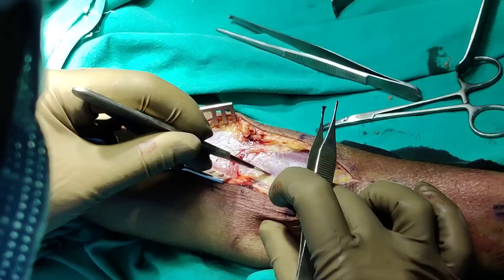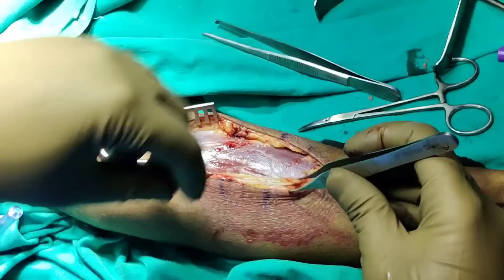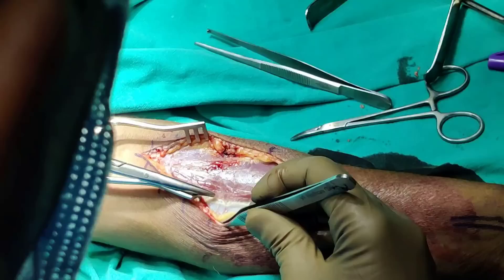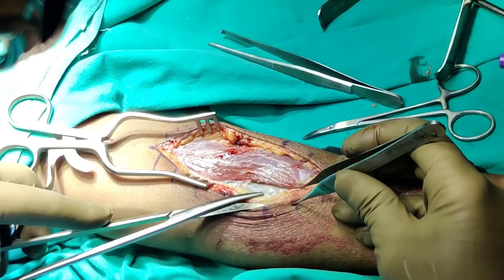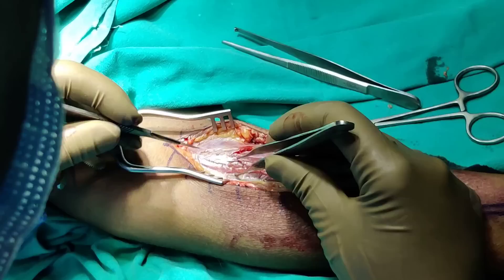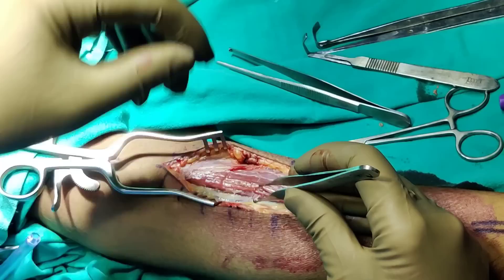The next step is to divide the fascia. You can see the brachioradialis is actually far more medial than you would expect. The brachioradialis is a big muscle and here it is almost halfway down — sometimes more than halfway down. You just need to identify the brachioradialis first. I am just going to use a 15 blade to identify the brachioradialis margin, working on its edge, and then lift it. The sign of good surgery is that you don't damage too many muscles.